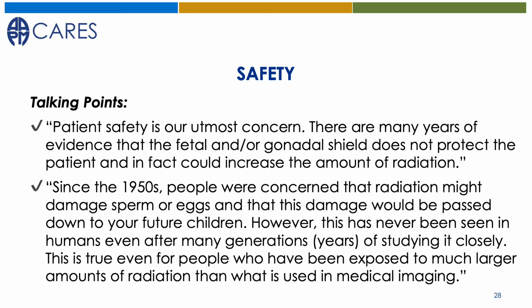Clinical practice should be based on the best and most recent scientific evidence. Although patients expect to be shielded because it has been common practice for many decades, we should explain to the patient the benefits from shielding are negligible, and thus there is no value to continuing this practice. Further, there is a small risk of compromising the examination if the shield enters the exposure field. There are situations, however, that may require special consideration.